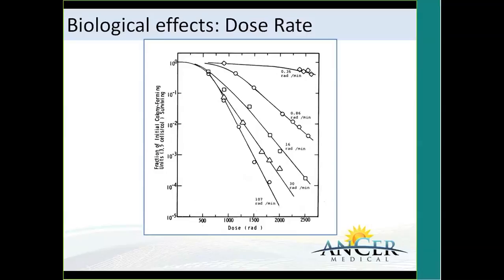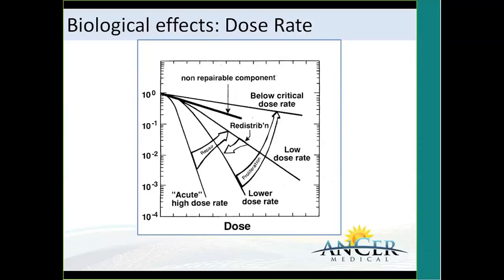What you really want to take away from this slide is that for high dose rates, you have no proliferation. If you go for low dose rates, you can have proliferation. Even when you have LDR permanent implants, seed implants, which many of you are familiar with, you're going to have both repair and proliferation. When you have HDR, there is no proliferation. And this is what HDR means.